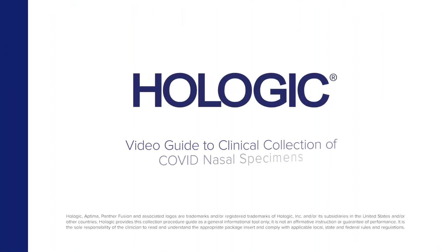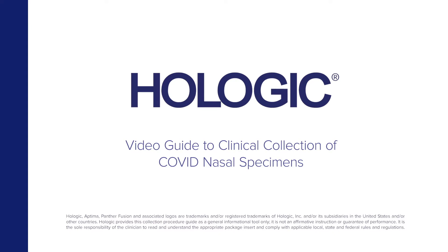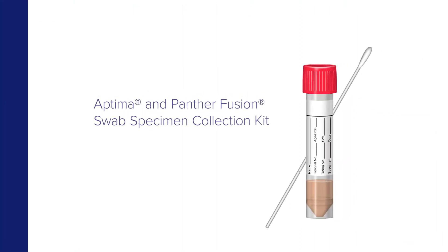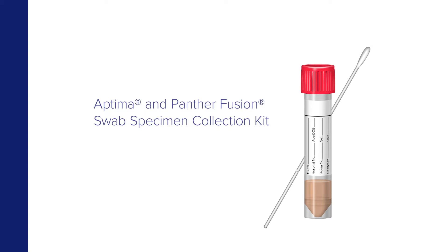Hologic presents a video guide to the collection of COVID nasal specimens by clinicians using the Aptima and Panther Fusion swab specimen collection kit.